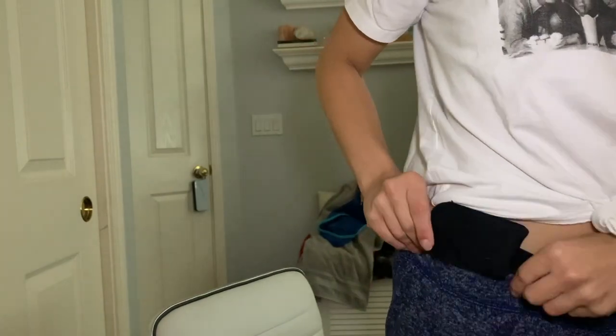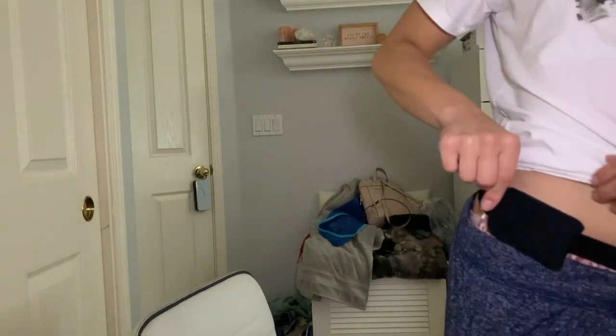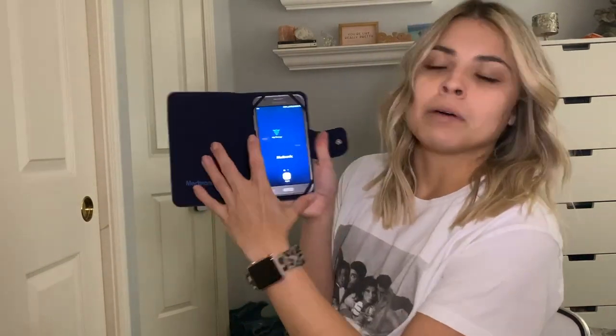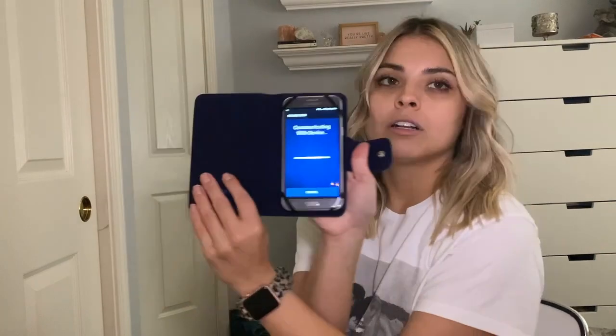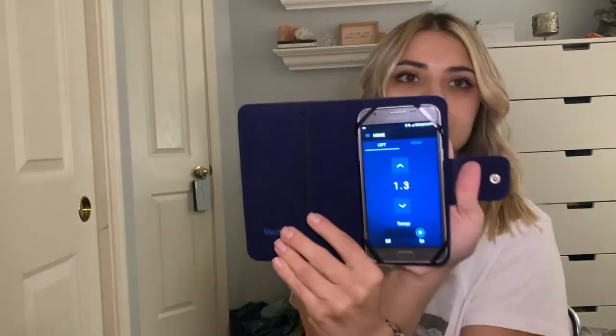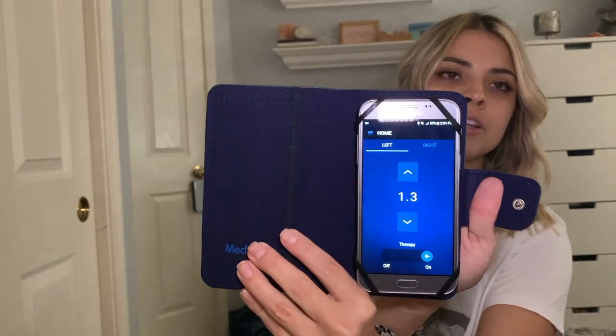So this is the battery right here that's connected to all of my wires on my back side. And what controls the brain or battery or whatever is this phone. And the only app on it is the My Therapy app. So you turn it on and it communicates with the device, and then you can control it from here, left side, right side, and how much stim you have, and then you can turn it completely off at the bottom as well. I just thought I'd show that to you guys because it's not what I expected. I was expecting like a box attached to my side, so I'm really glad that it's a phone that's Bluetooth and not something I have to carry around all the time.